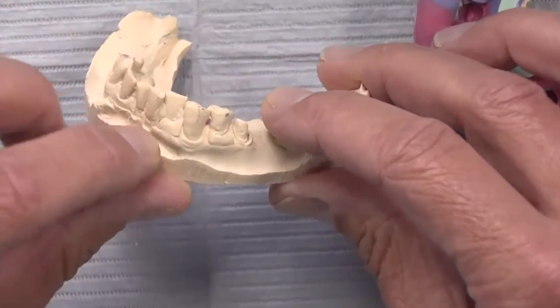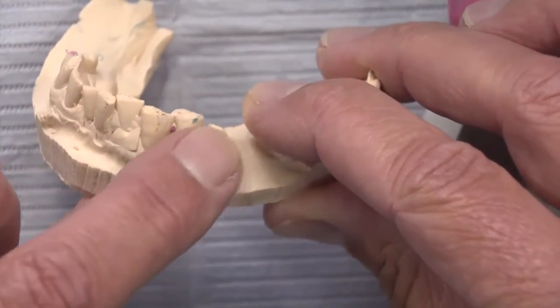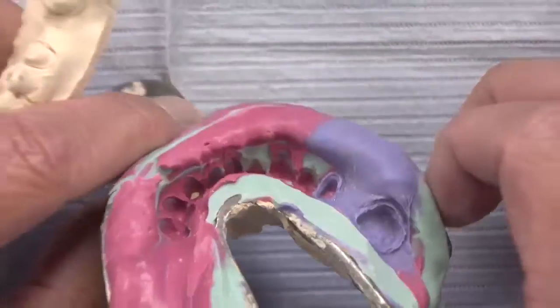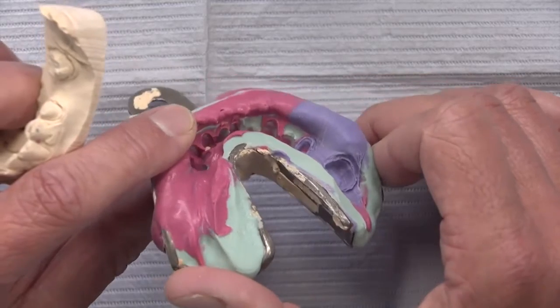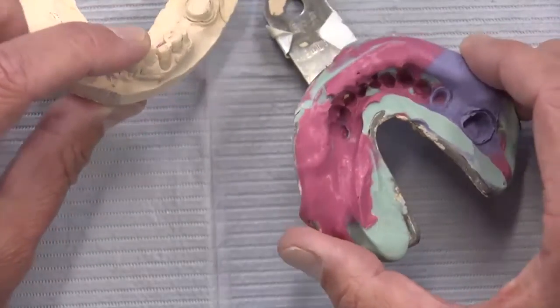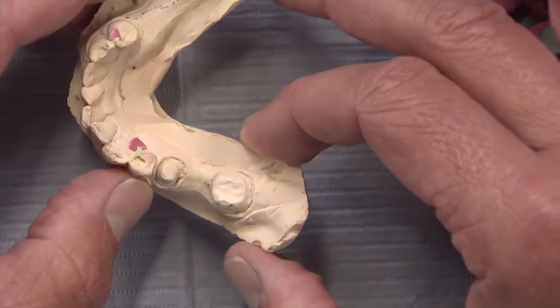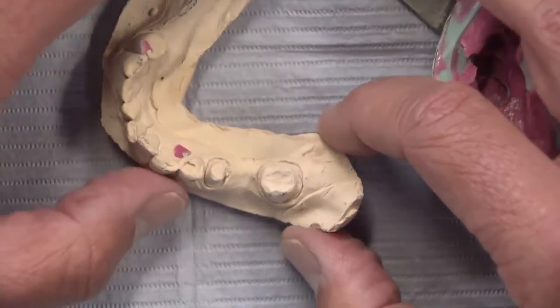And you can see other areas where that's happening around here where material stops and another one starts along this area. So this is, 1, 2, 3 teeth in front of the preps. As you look here on that lateral incisor, and if we look back at the impression again, and you can see on that lateral, that's where the green is, and there's no red material in that area. You can see there's red material on both sides of it, but not on that lateral incisor. And so as that happens, as we move around and look, there's discrepancies on the occlusal surfaces of the teeth as well. And so this is one of the reasons why taking these different layered impressions, these bilayered impressions, is difficult.